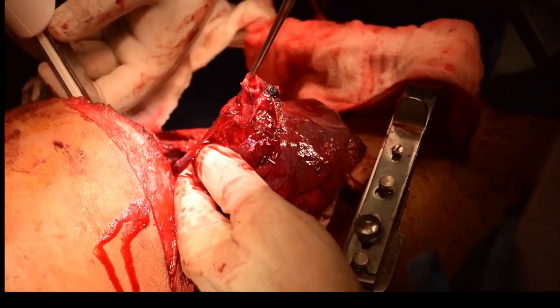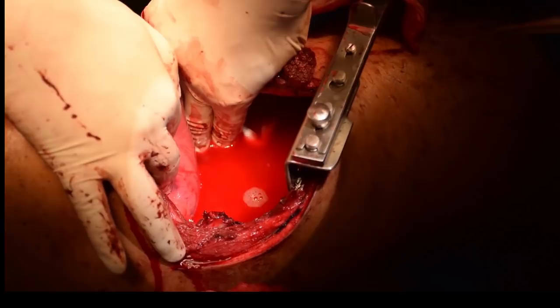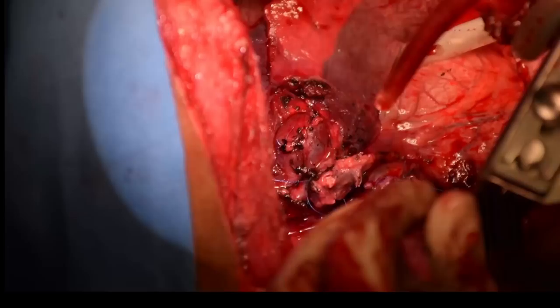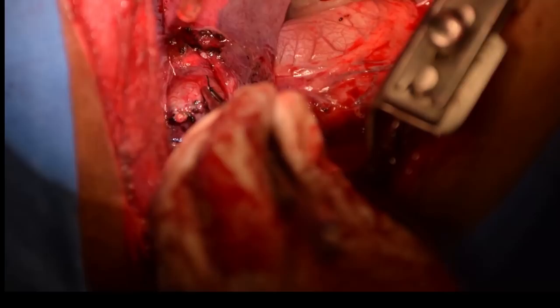As we routinely do, we checked the bronchial stump for any leak by having the anesthetist hyperinflate the lung to 30 mmHg pressure. That is showing the inflating of the lung and checking all suture lines — the pulmonary artery repaired with 6-0 Prolene. The artery to the middle lobe and to the inferior part of the upper lobe was left intact.